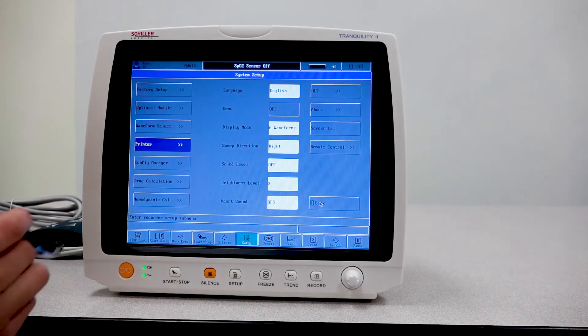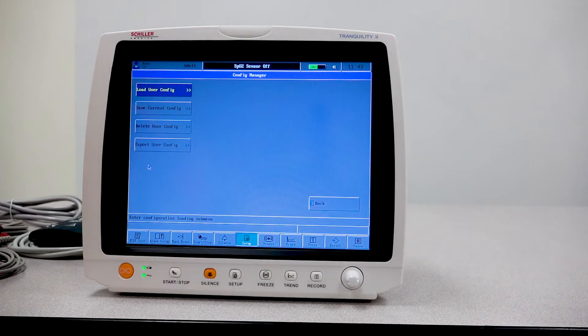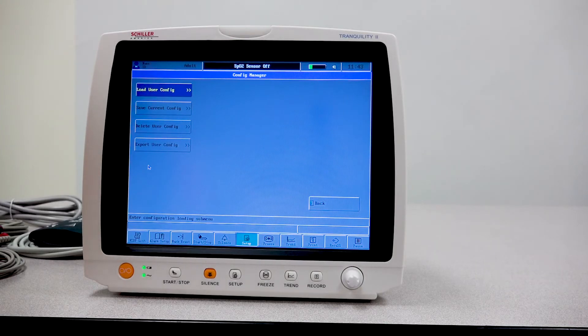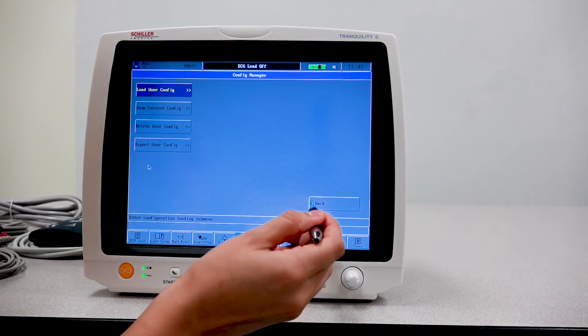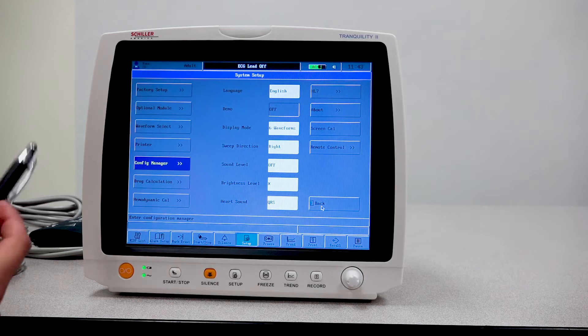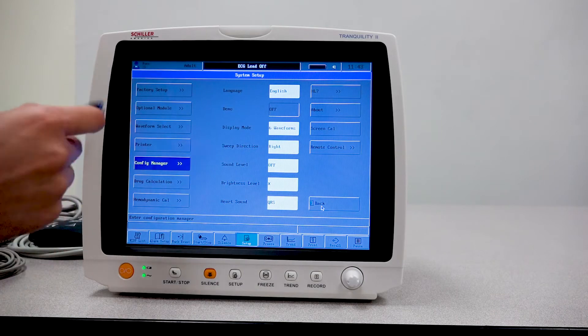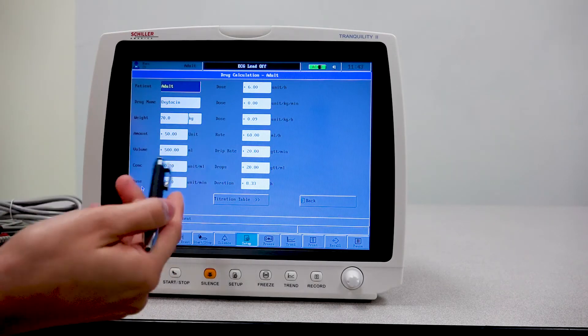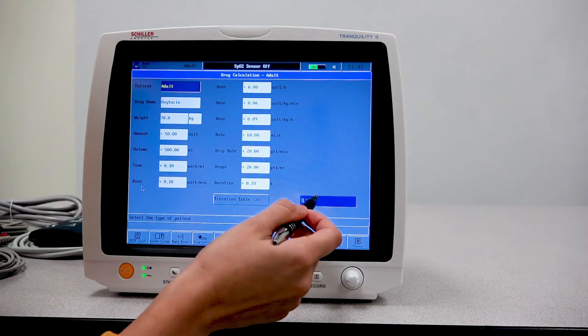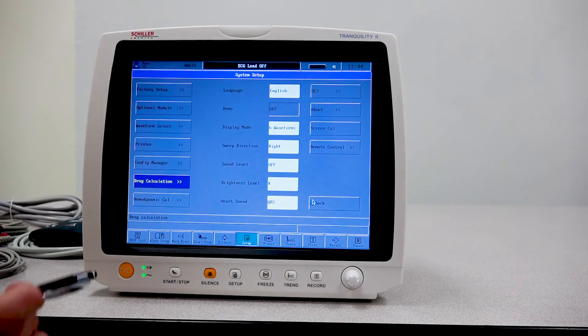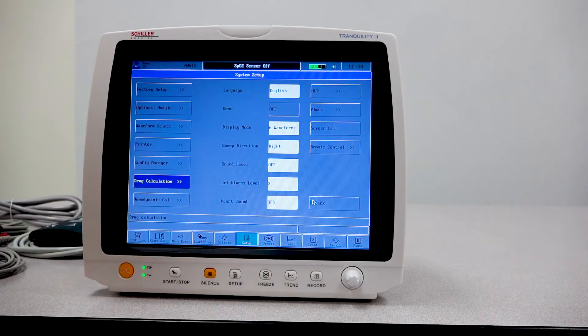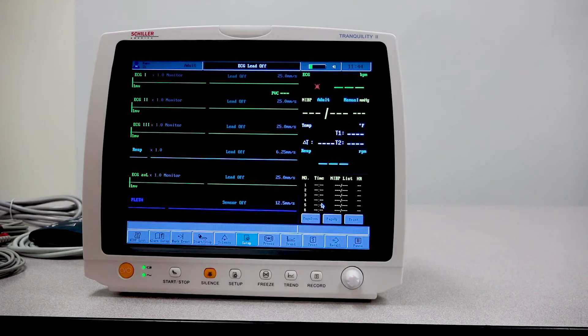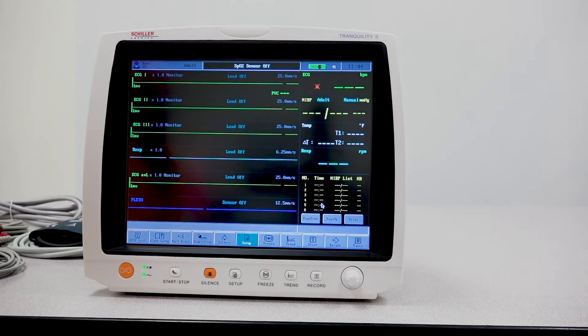You have the configuration manager. This gives you the option to configure any users that will be using this monitor. You have the drug calculation, which is used for the nurse or the doctor for them to enter the information of the medicine or the medication that is being used and how much of it. You have a few other options here that you can navigate through as well.